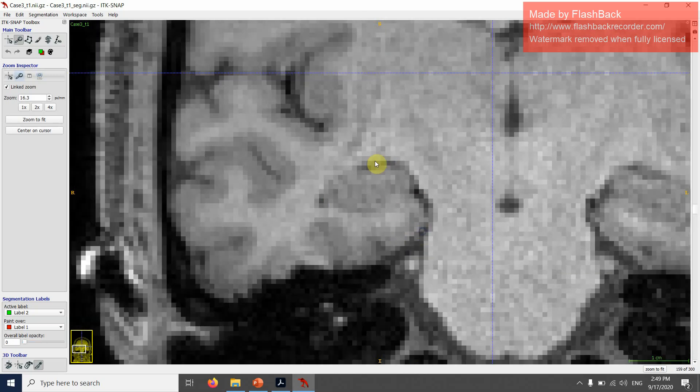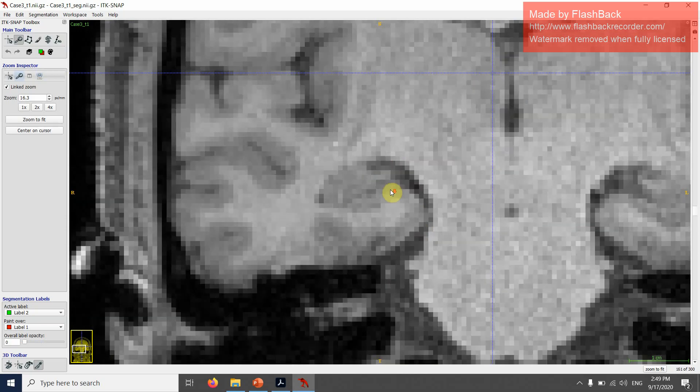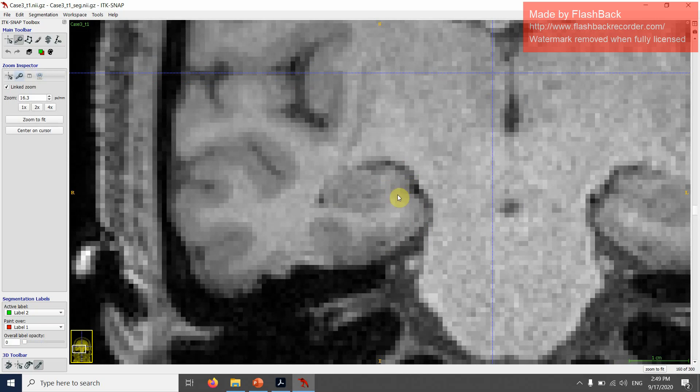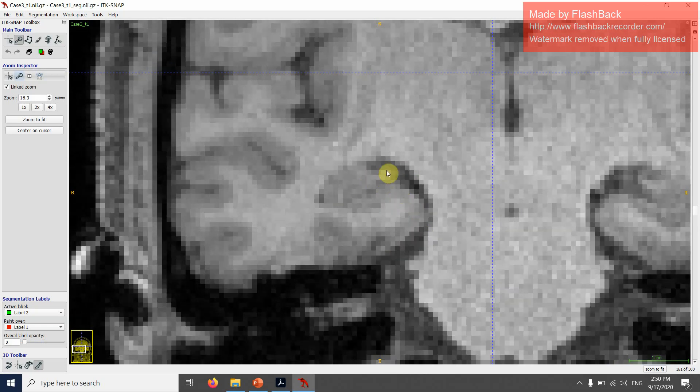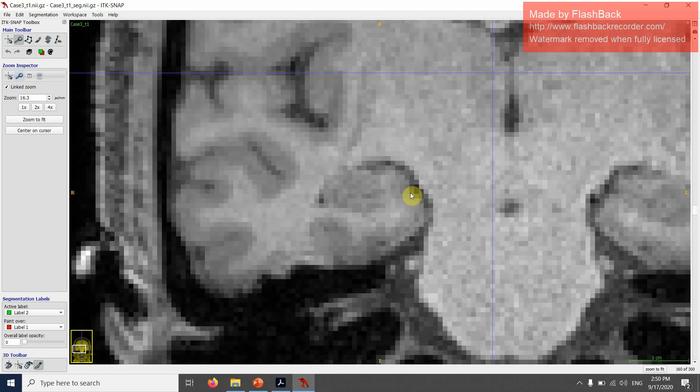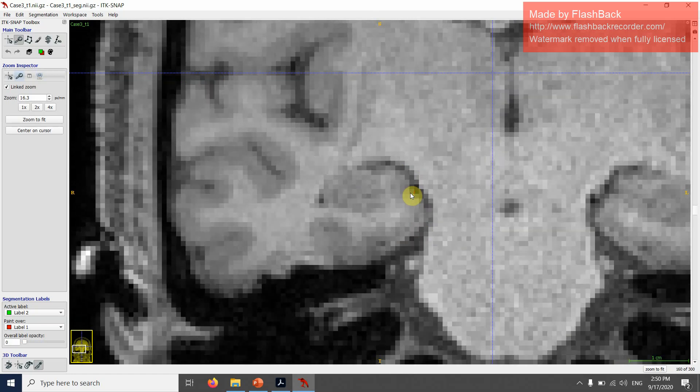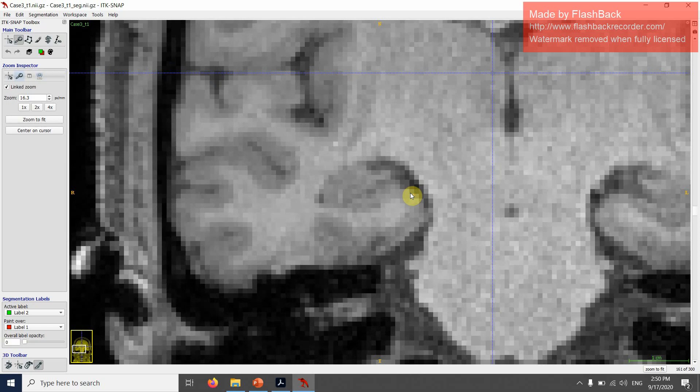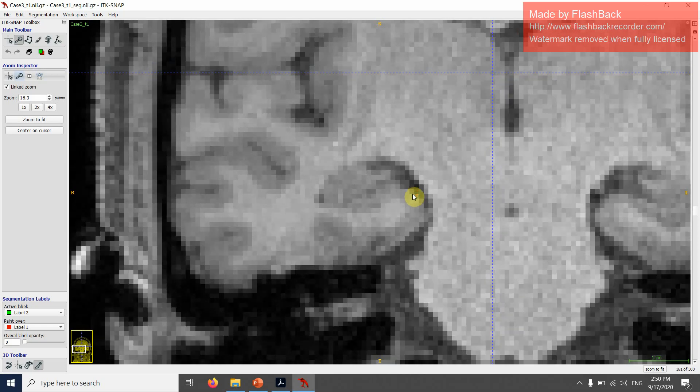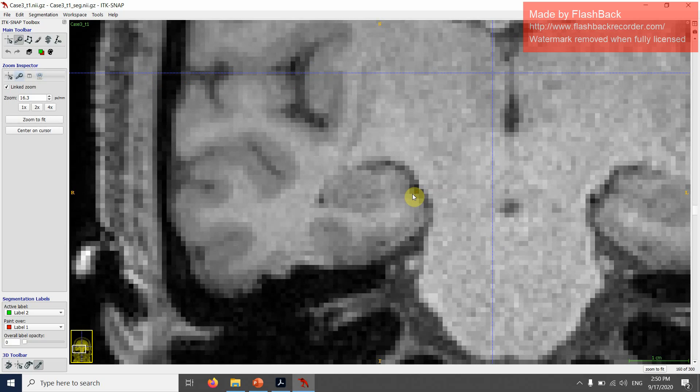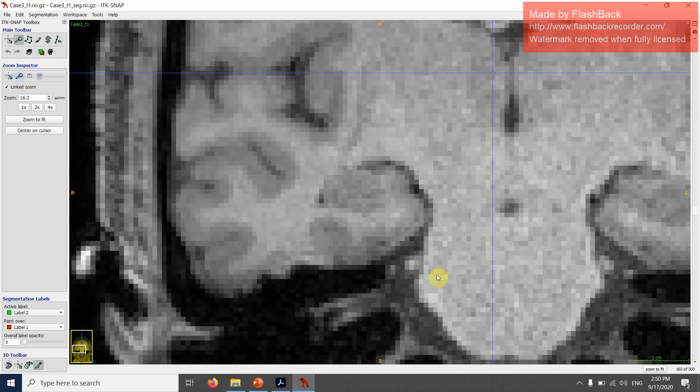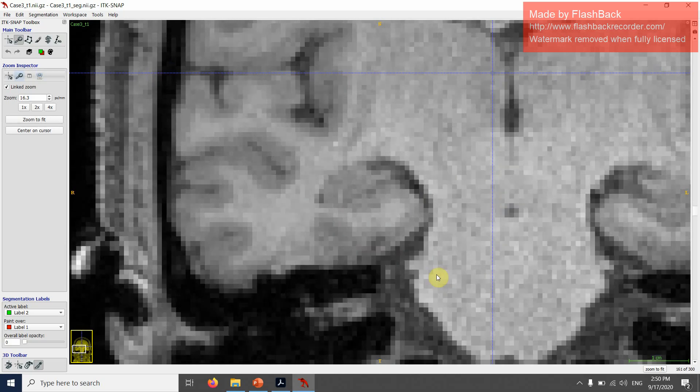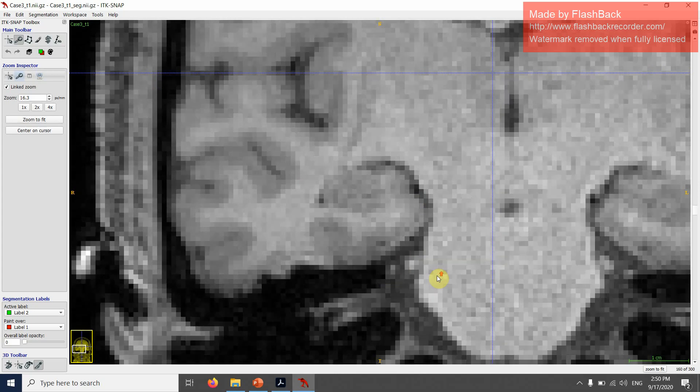Just to show you it without the label: this is the uncus, this is the uncus, and then it disappears. You still see some white here, but that is the fimbria. That's generally very hyper-intense. I hope you see the difference between these two slides. This is a little bit more difficult, but I think once you get used to looking at the hippocampus on these T1-weighted images, it will be easier.